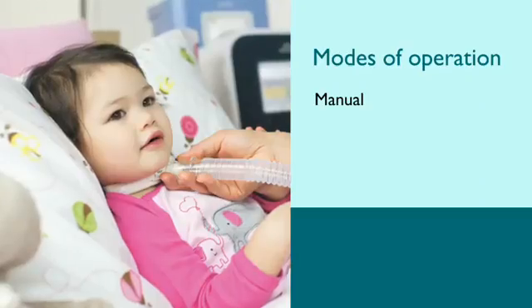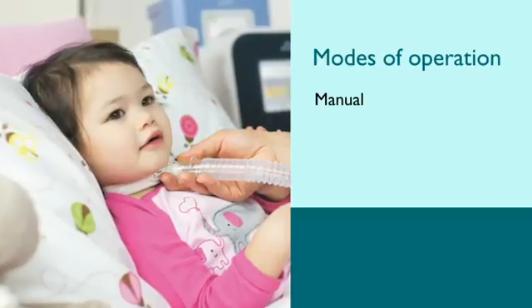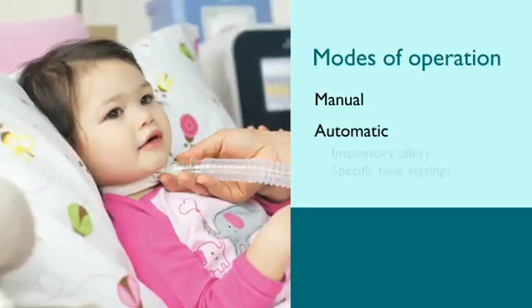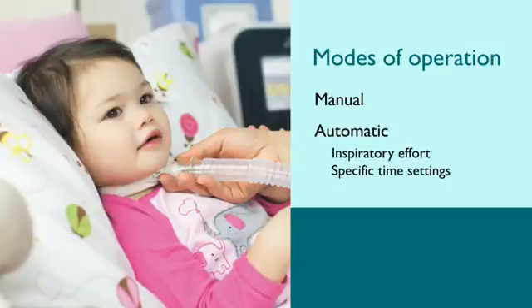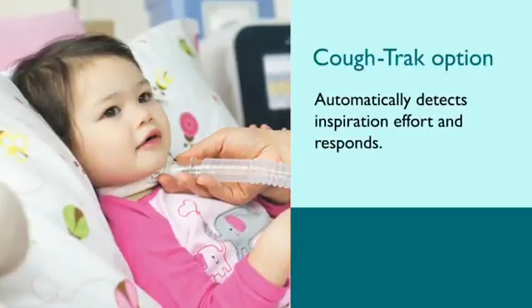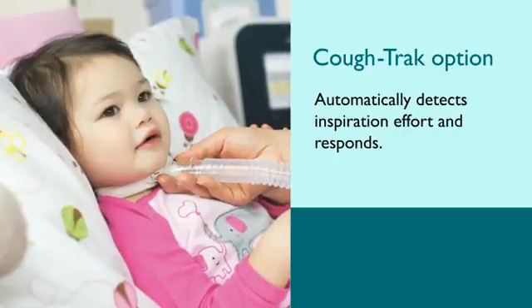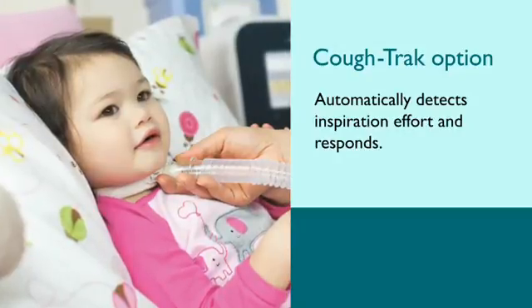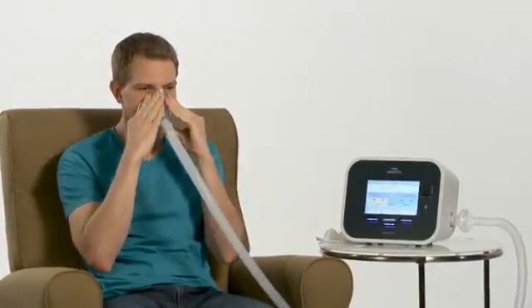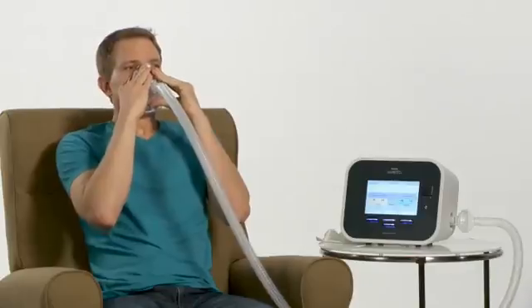CoughAssist T70 can be operated manually, which you have just seen demonstrated, or in automatic mode. In automatic mode, inhale, exhale, and pause times are controlled by the time settings entered. When using the cough track option, the device will automatically detect inspiration effort and respond with an inhalation. With automatic operation, there is no need to toggle the manual switch between inspiration, exhalation, and pause.